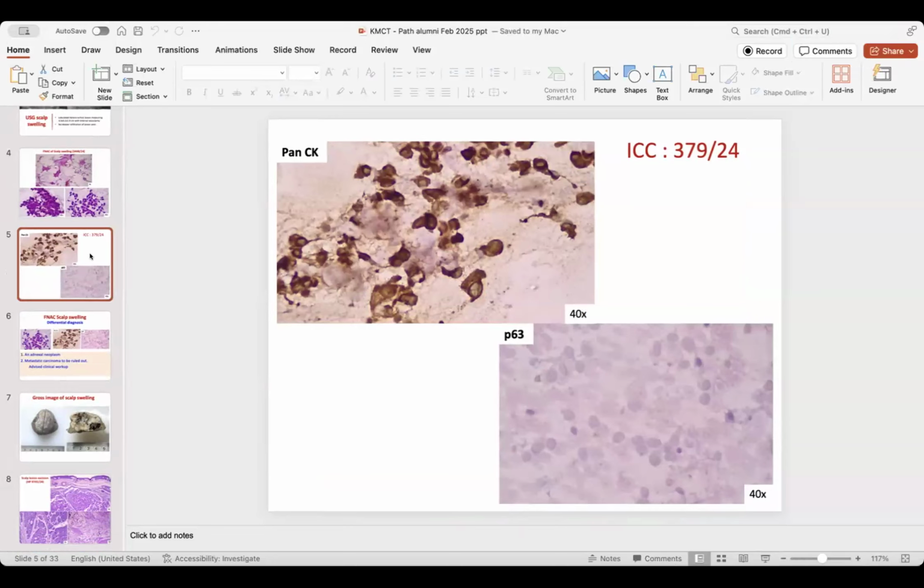We do it even in effusions, sometimes pleural effusion, to differentiate adenocarcinoma, and we do the IHC with FNA. From Calicut onwards, we do. No, we do cell blocks, madam. We do it on cell blocks. Yes, cell block, and also on the smear we can do it. It comes out well.